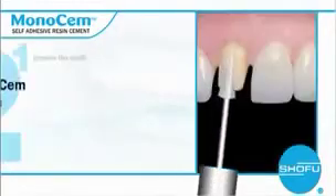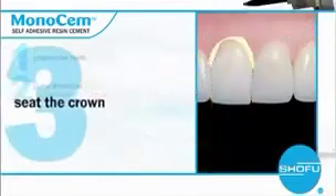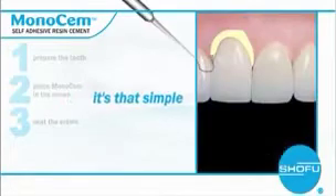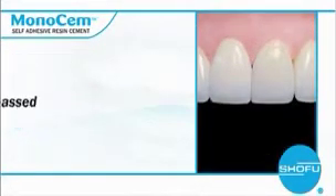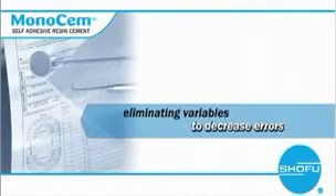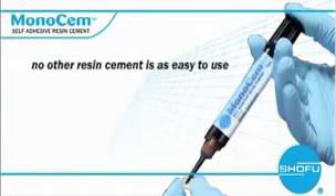Simply prepare the tooth, place Monosem directly in the crown, seat the crown onto the preparation, and self-cure it or light cure it. It's that simple. Not only will it provide the retention strength you expect, but aesthetics are unsurpassed. It's completely forgiving by eliminating variables to decrease errors considerably. No other cement is as easy to use.